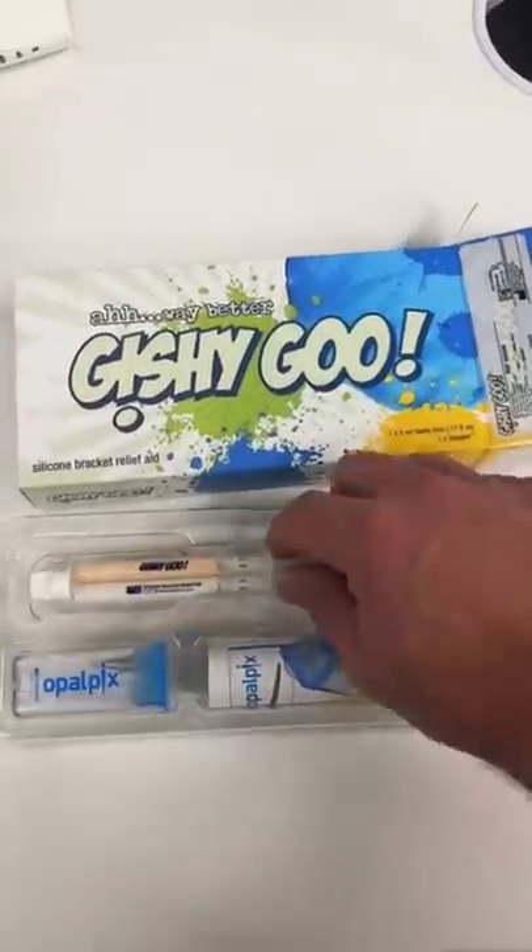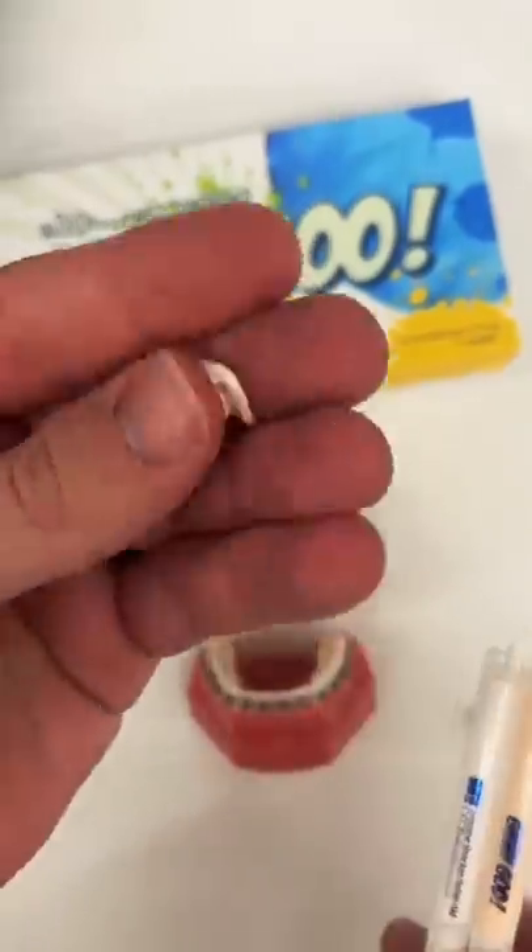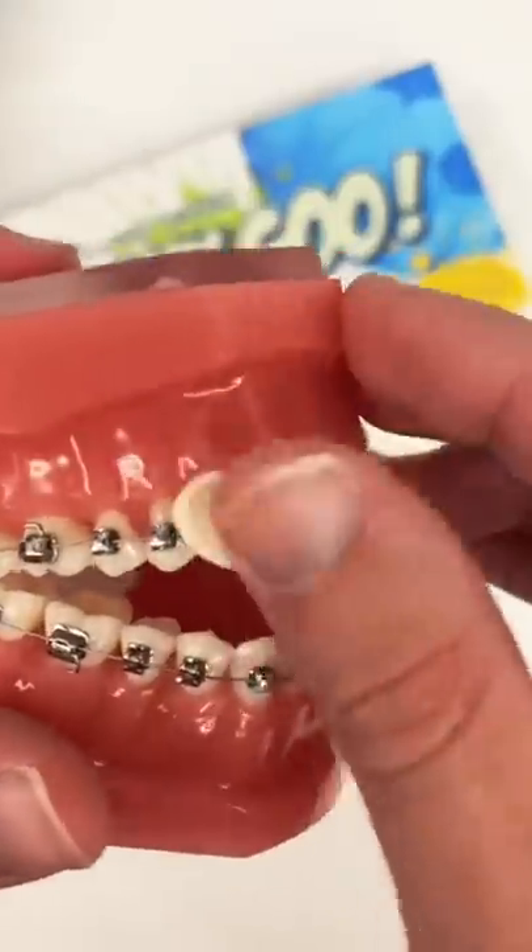Gishigoo is a braces wax alternative made out of silicone. Simply pop the top and push out both sides of the gishigoo, roll into a ball to activate, and place on your wires.